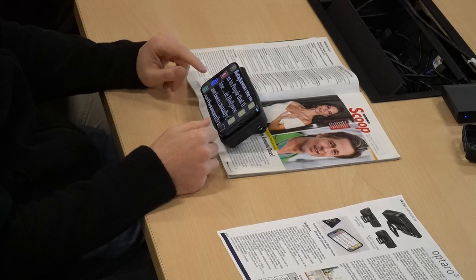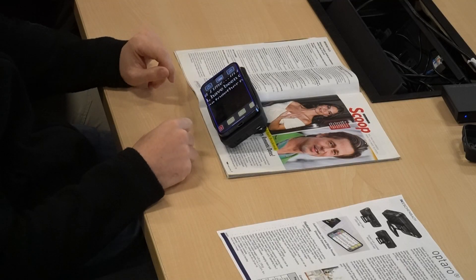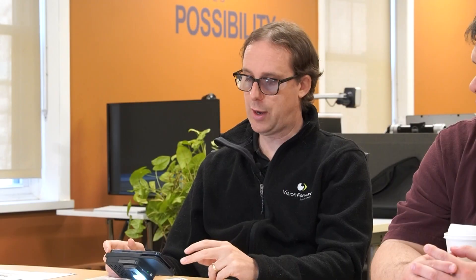The next button down on the left side is the camera button. We can go ahead and take a picture. The Optaro app needs access to the Photos app if we want to save photos, so I'll go ahead and allow access. That gives us a frozen image on screen, we can zoom in on it, and we can snap a pic and share it in the usual ways — via AirDrop, text message, or email.